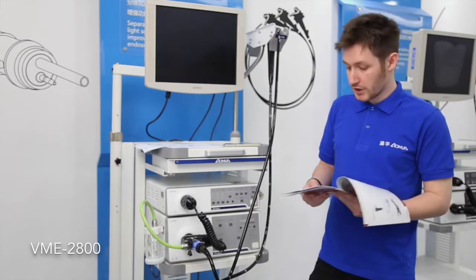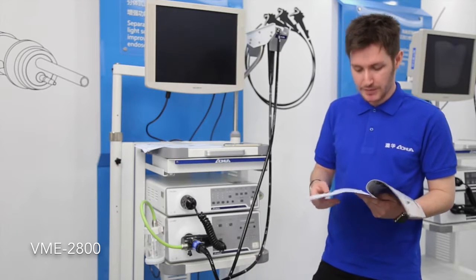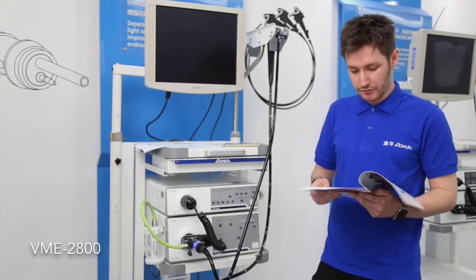It offers more functions than the previous system. There's an optional USB recorder, which allows you to store your pictures on a USB disk for easy transfer.